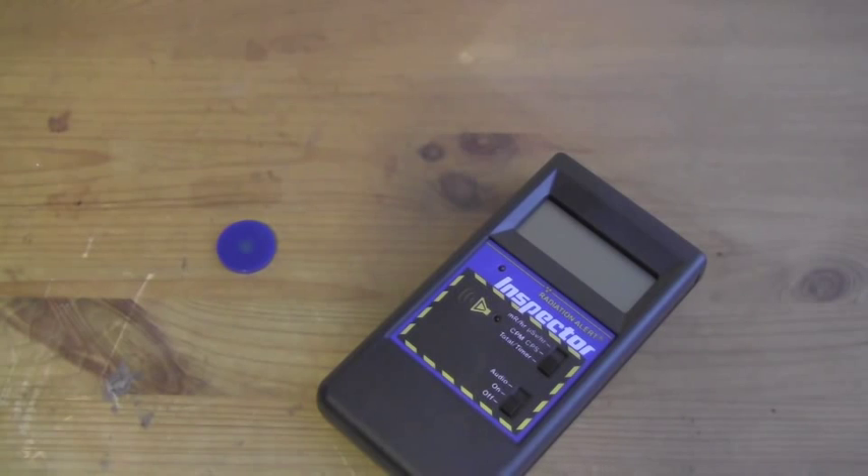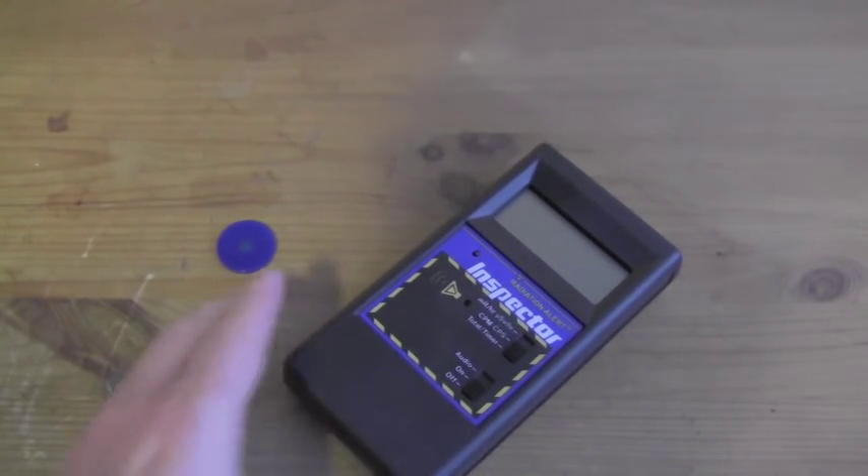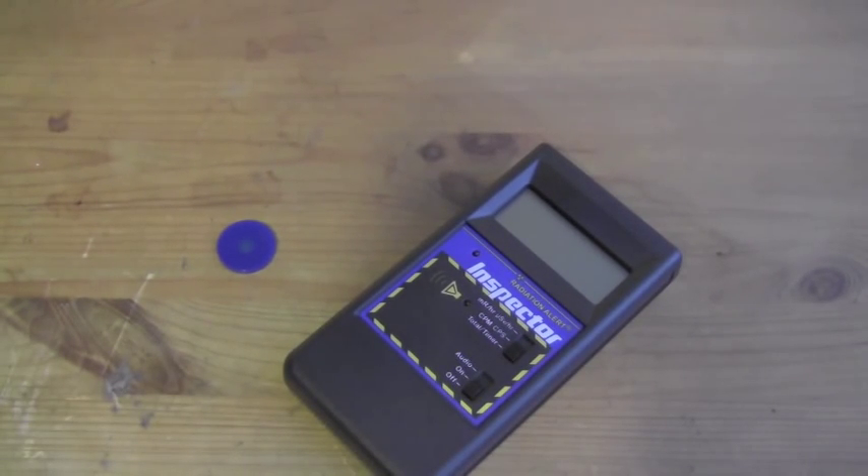Options available with this survey meter include a wipe test plate, a stand, a protective rubber boot, and the Observer software for PC interface. You can see the details of these options on the website, as well as more detailed specifications.